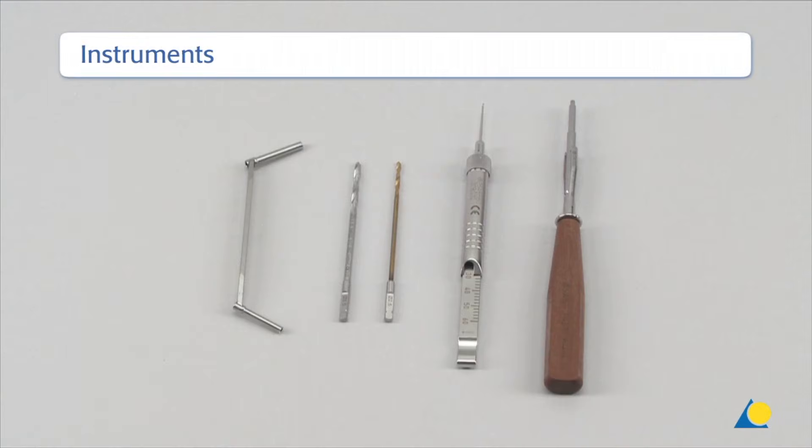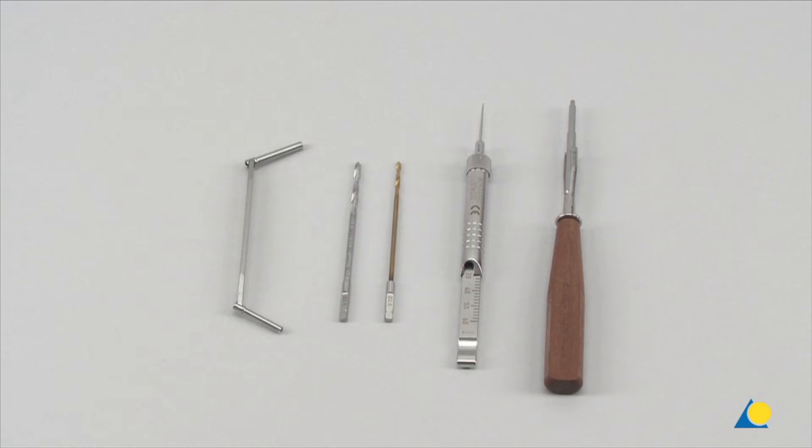The instruments required to insert the 3.5 mm self-tapping cortex screws are the 3.5/2.5 mm double drill guide, the drill bit 3.5 mm diameter, the drill bit 2.5 mm diameter, the depth gauge, and the screwdriver hexagonal small 2.5 mm diameter with groove and holding sleeve.